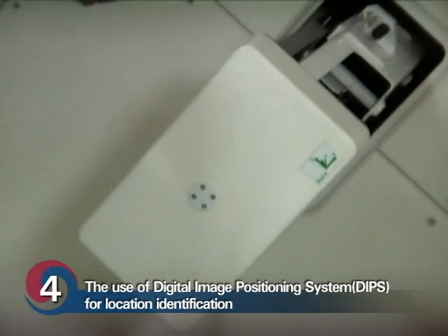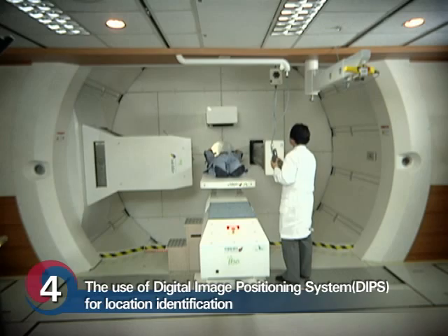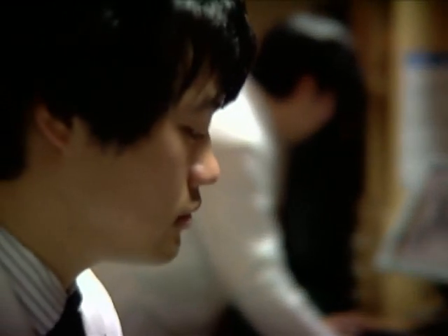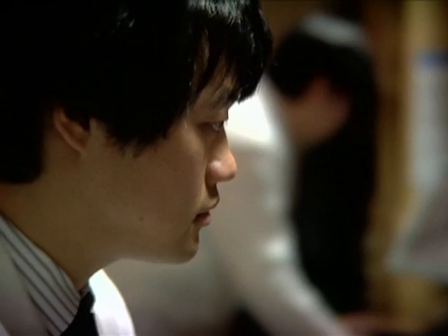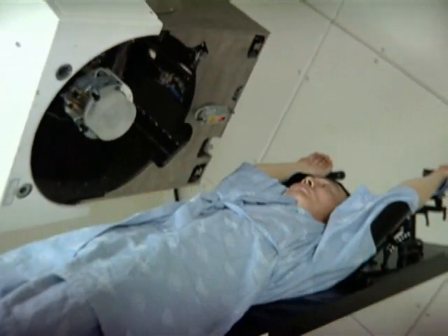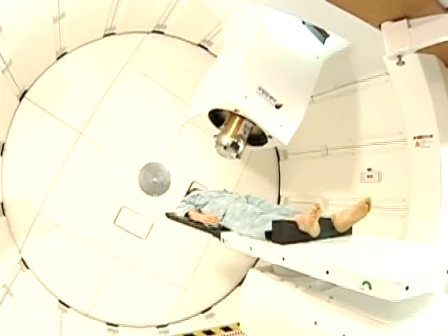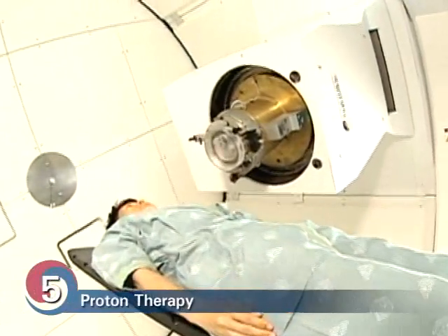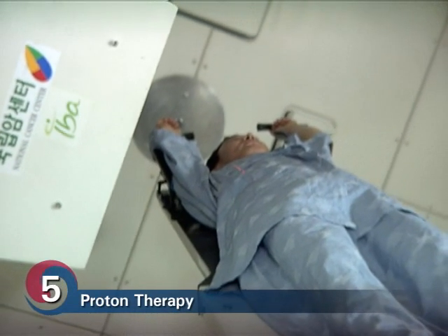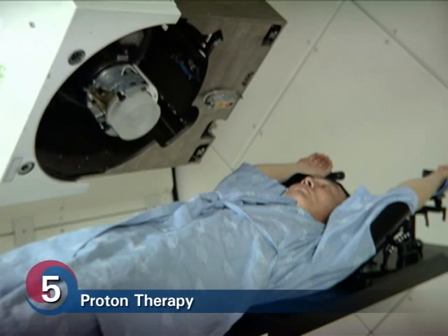The digital imaging positioning system is used for identifying location — this is the process of finding the exact treatment location for the patient before the start of therapy. Using the optimal computerized therapy plan and practicing this process every day, more safe and accurate radiotherapy can be performed.